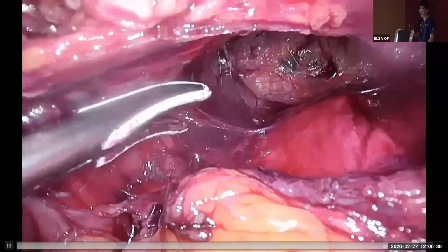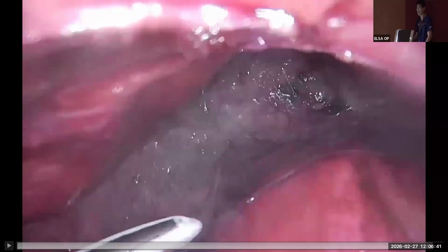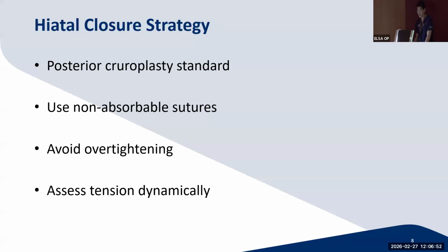One of the other drawbacks is that sometimes the patients with very bad esophagitis or very severe or very chronic hernias, then we need quite a lot of dissection, and you may get a little bit bloody. So use of an energy device is sometimes quite helpful.